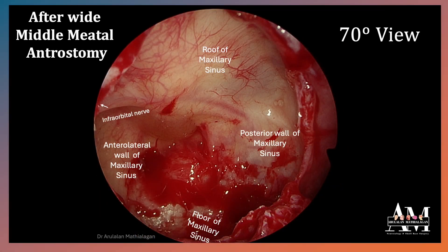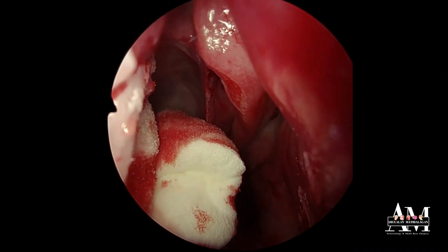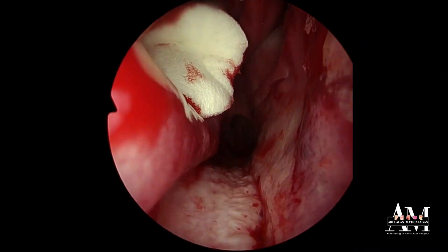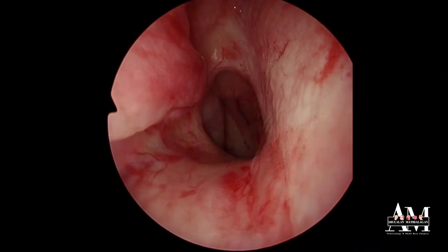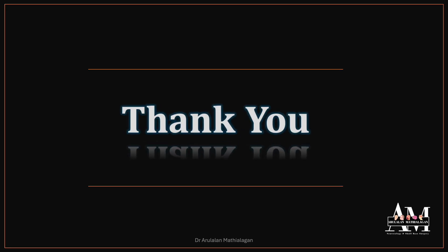That is the infraorbital nerve, and that was where the polyp was attached. After packing, this is the nasopharynx. Thank you.